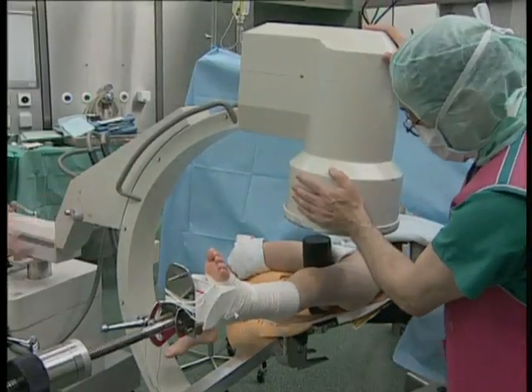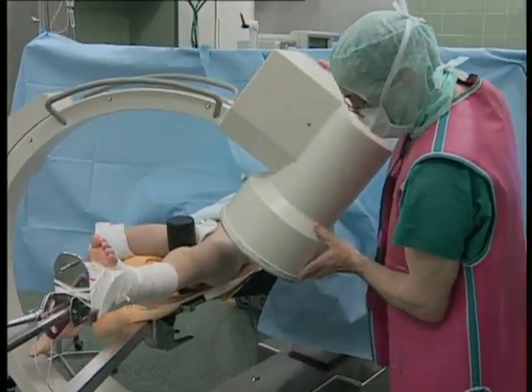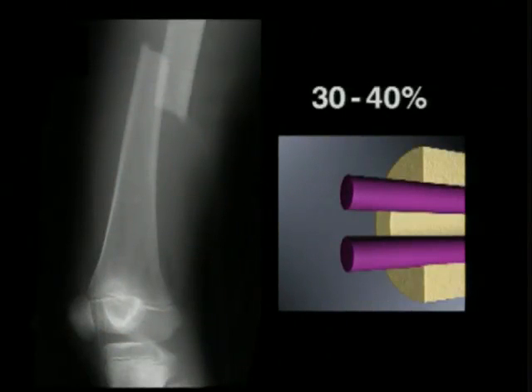The image intensifier should be positioned so that even with a sterile covering, it allows radioscopy of the whole leg. The isthmus of the medullary cavity is measured on the X-ray image. The diameter of the individual nails should be thirty to forty percent of the diameter of the medullary cavity. Nails with identical diameters must be used.